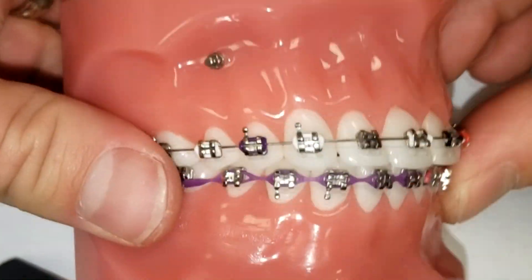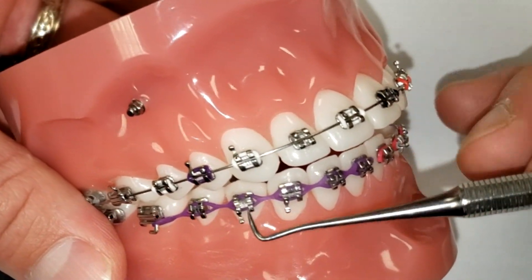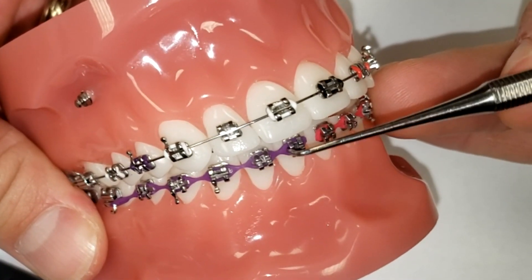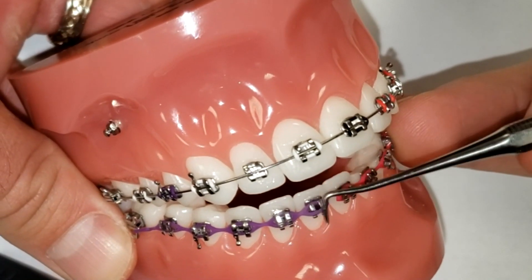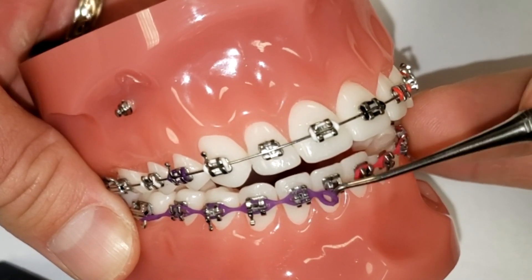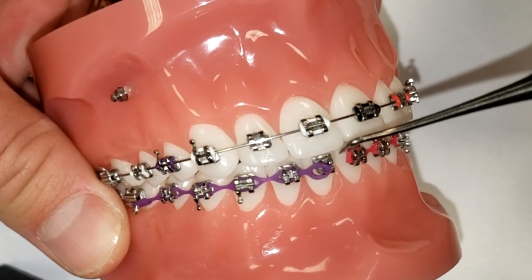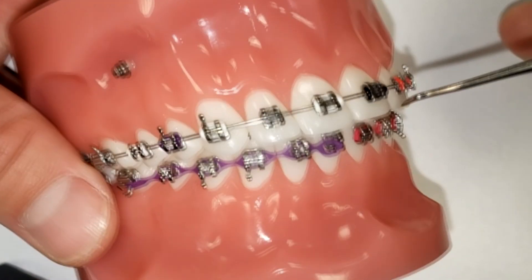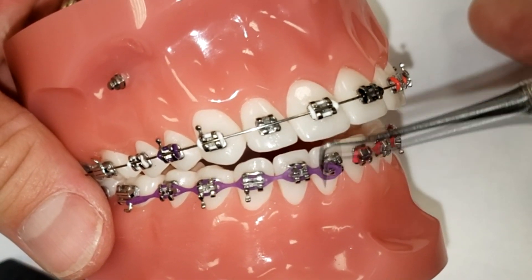Now on the other hand, if it's power chain, that's a little bit of a different story. This purple color going down through the bottom right here — that's power chain. And if one of them pops off, let's say it's kind of coming off and just hanging like this off the bottom, or if the whole thing is kind of dangling like that, that's a different story. You probably need to contact your orthodontist and get in to see them somewhat soon — not urgently, not Saturday at midnight, but probably within a week or two, just so they can get that taken care of.